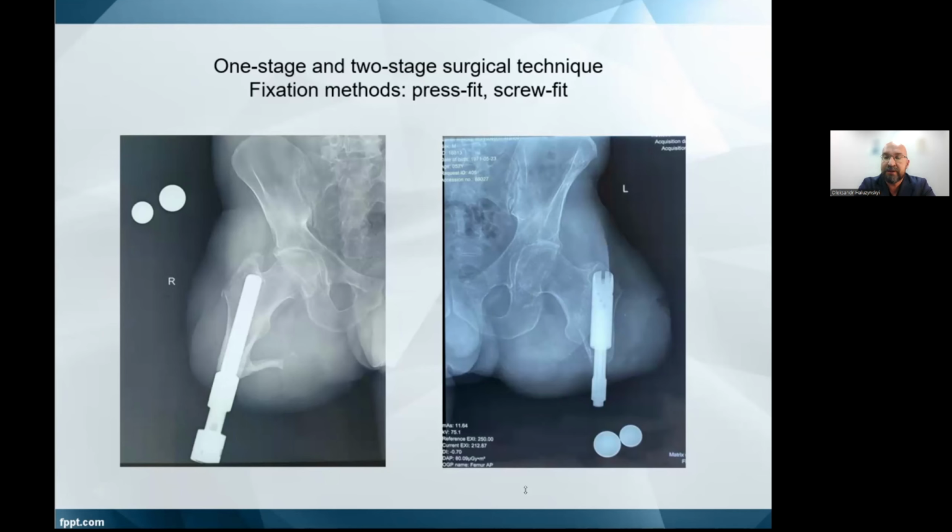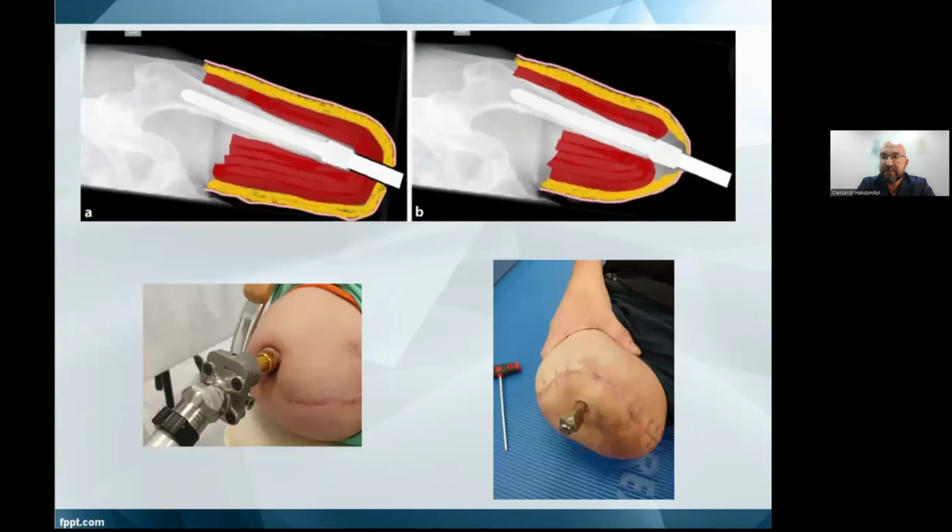Despite the fact that manufacturers of press fit implants claim the possibility of early loading, the unconditional advantage of screw-fit implants is the possibility of their use in super short bones of amputation stumps. These two techniques also differ in the treatment of the soft tissue of the stump. The abutment of the press-fit implants is coated with titanium nitride, on which the soft tissue slides. Serous discharge is normal according to the manufacturers. Such a stoma is called wet. When using the two-stage screw-fit technique, the soft tissue is tightly fixed to the bone cut, forming a dry stoma.